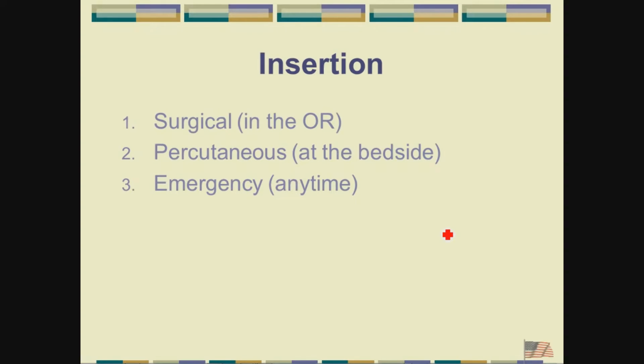As far as a procedure, it's nasty, to me at least. It is, but the surgical site is a lot nicer than the scar of a surgical tracheostomy. Basically what they do is they take dilators and just ram them in. They are sedated, and they gradually increase the size of this opening. It's barbaric to watch in a way.